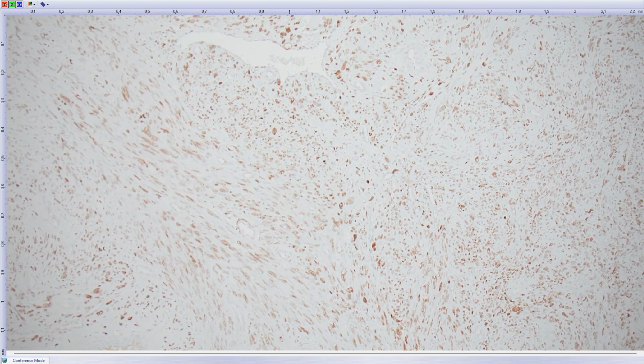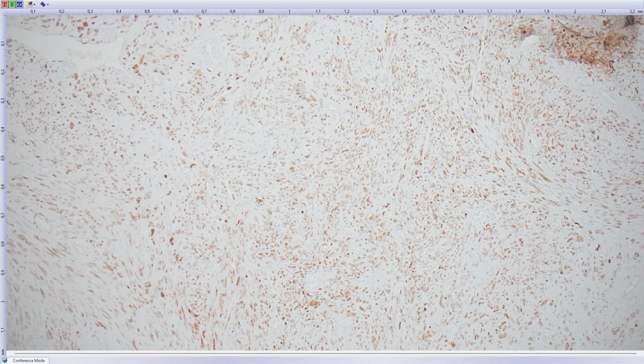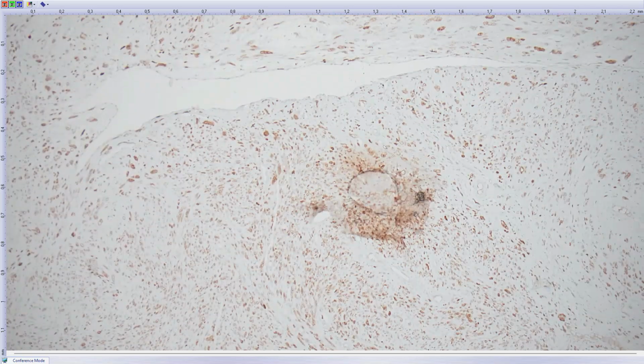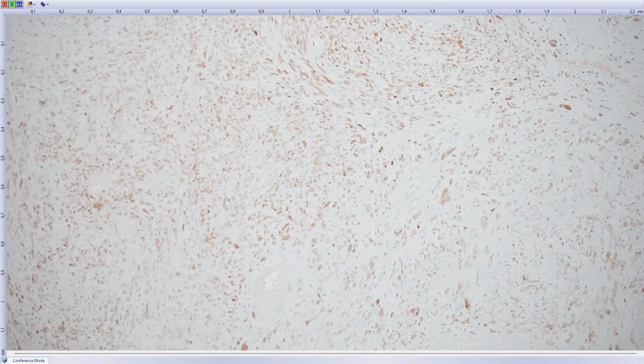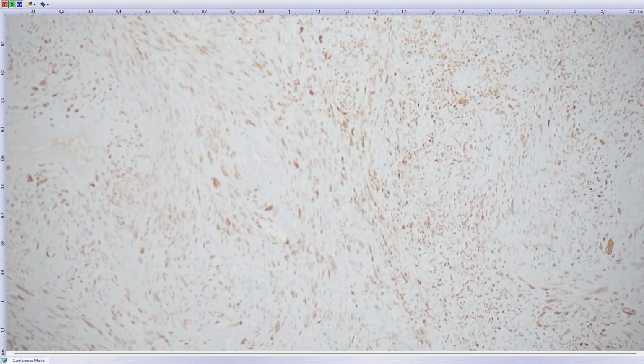The second subset of leiomyomas, so those RB1 deficient or TP53 mutated or P53 abnormal, can have either just one feature or both of them. So this was another subset of leiomyoma. In this case, there was no additional workup for the patient, and we can close this up as leiomyoma with bizarre nuclei, so-called type 2.